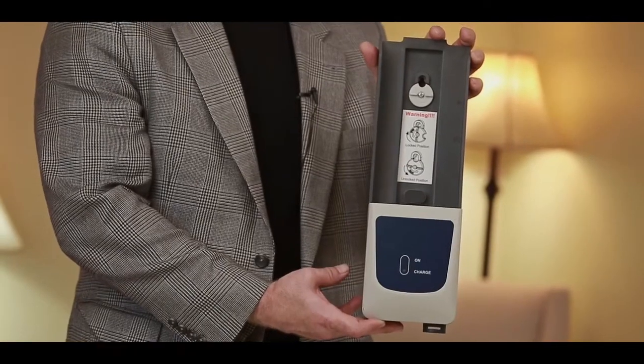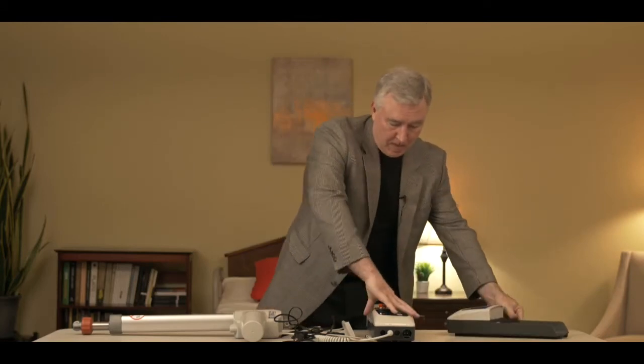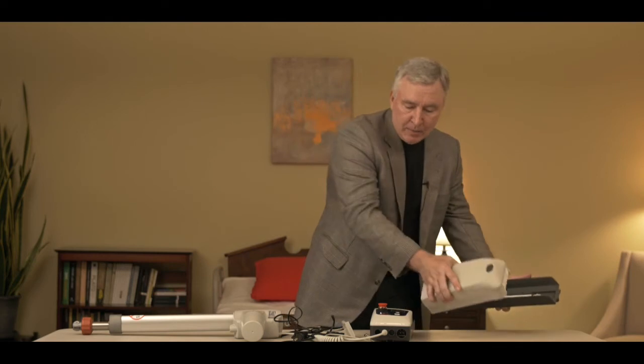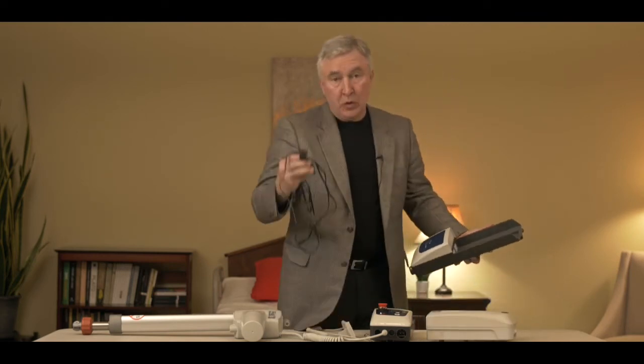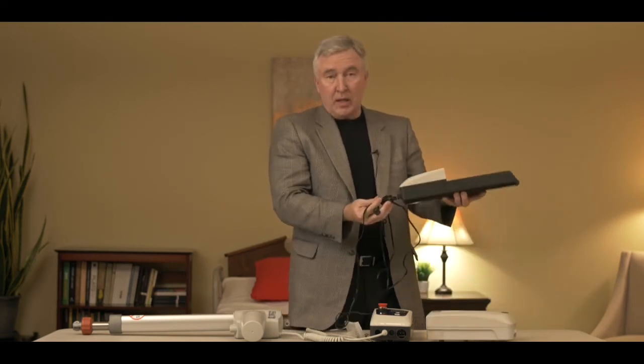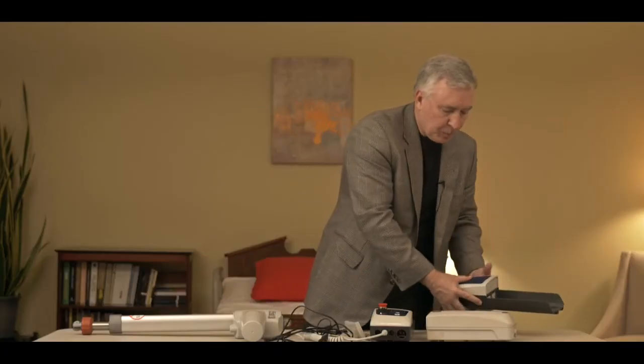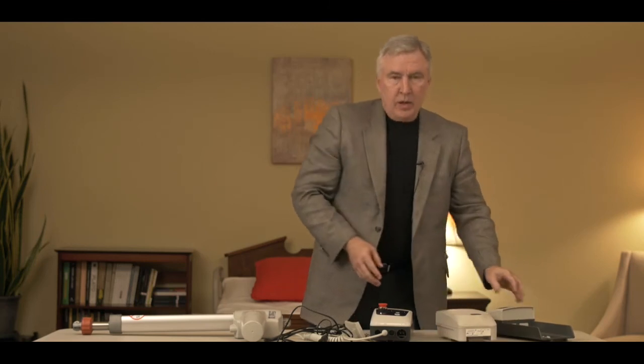I brought a wall mounted charger to show you. This is what that looks like if you decided to buy that. It mounts on the wall — just hang it up — and the battery slips into it just like the control box. The same charging cable that's used to charge the lift would plug into the bottom of the wall charger to charge your secondary battery. So now hopefully you have a better idea how to troubleshoot your Style 2 electronics.